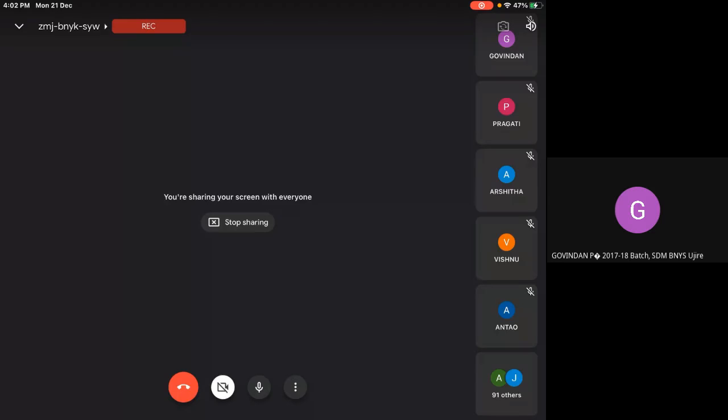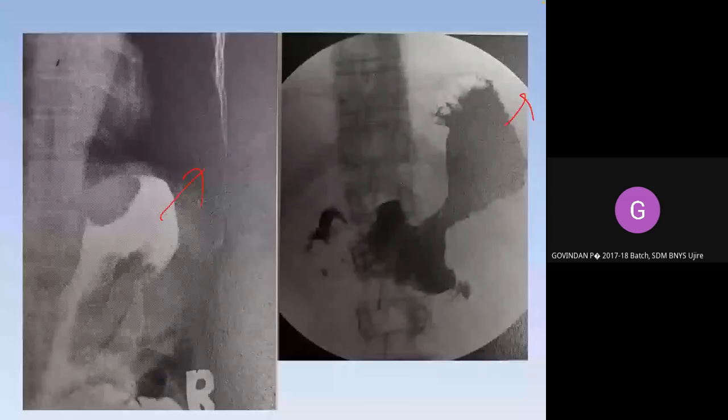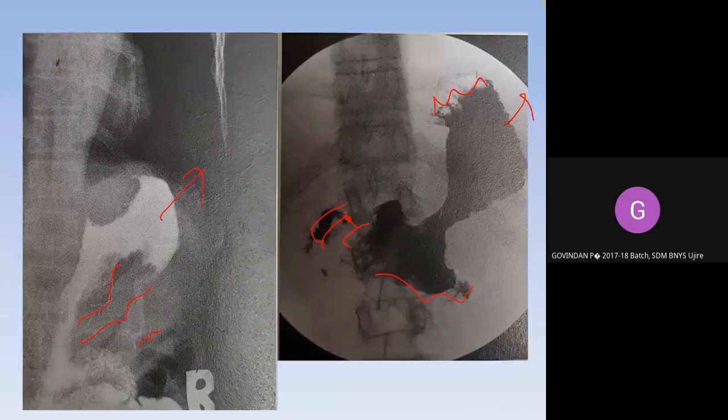Looks like a carcinoma. Why I'm saying carcinoma is not because I have added the image, but because there are a lot of strictures, okay? That is, fibrosis has taken place. A lot of filling defects are there. These are the remnants which are cut off, stenosis. And this is one ulcer, this is a growth that is there. And you can see minor ulcerations there, that is depressions there. This could be a growth that is there. Probably gastric carcinoma.